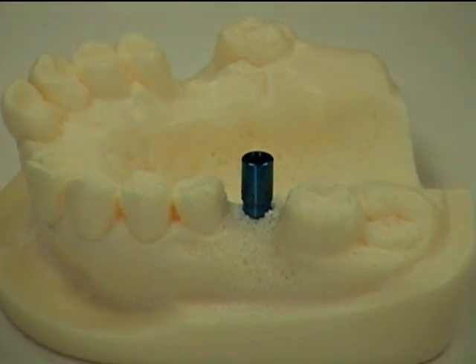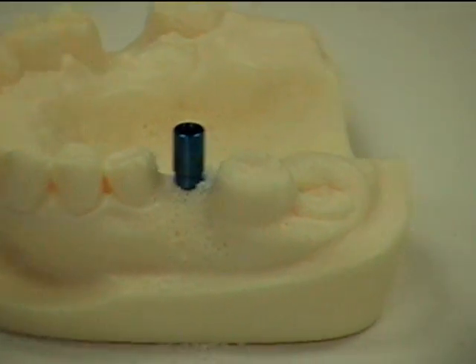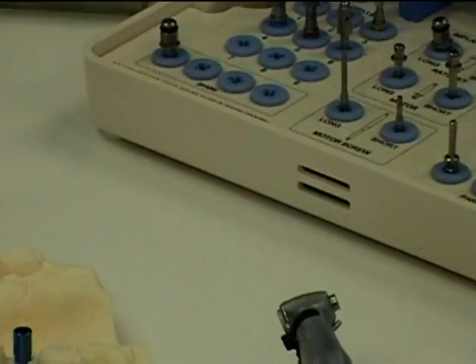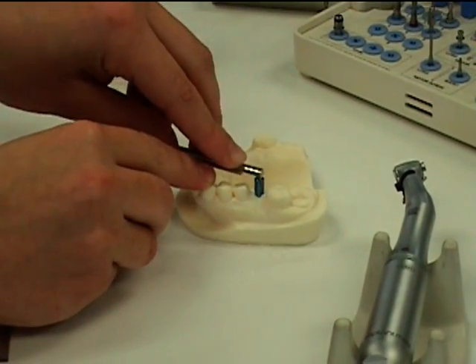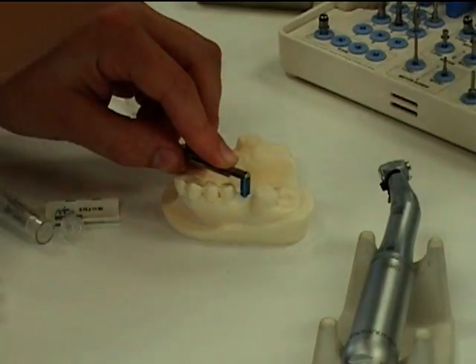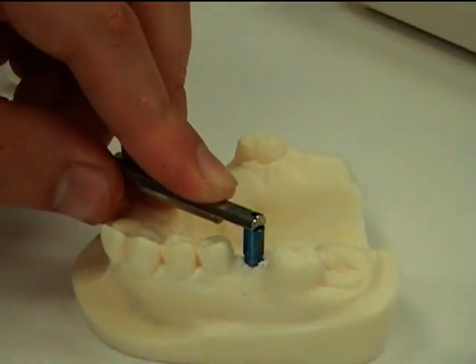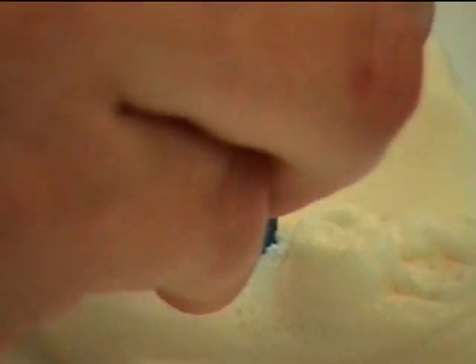We'll then release the fixture mount. The holding mount key goes into place in the fixture mount. That will prevent the implant from turning so that only the screw may turn.